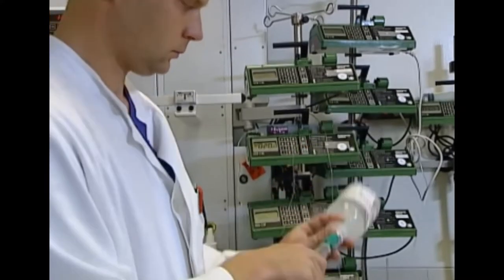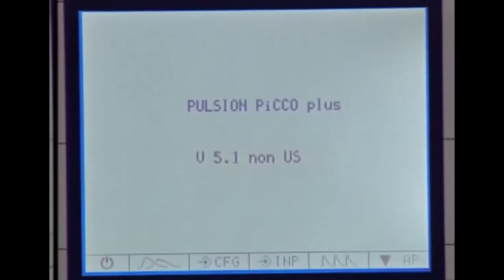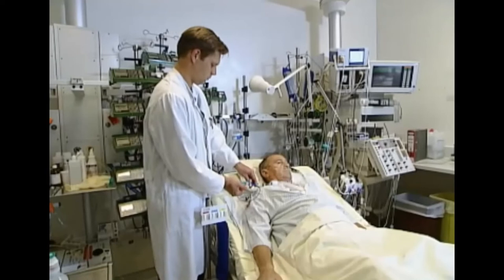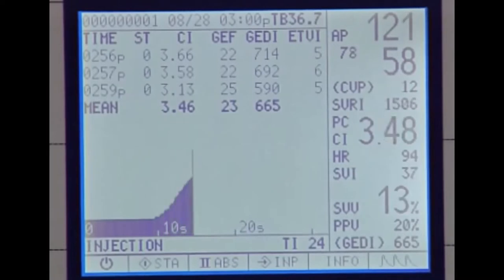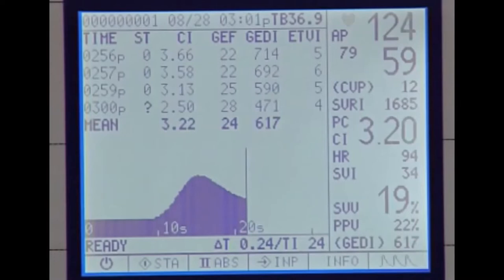Now prepare the injectate for the thermodilution measurement. To start the first series of measurements, please select the thermodilution menu on the PiCCO Plus screen and press start. The injection can be started as soon as the message stable appears. Please ensure that the bolus of every measurement will be injected steadily and in less than 5 seconds. After approximately 10 seconds, the temperature bolus will have passed the tip of the arterial catheter and the temperature changes will be displayed on the screen. We recommend performing 3 thermodilution measurements, one after the other. A recalibration is necessary every 8 hours, or if the hemodynamic situation of the patient changes drastically.